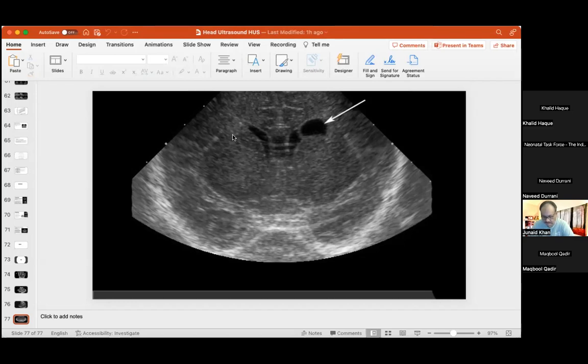I have two comments on your presentation, please don't take it personally. I'm just highlighting it because a lot of junior learners are sitting here. One is about the color Doppler and color pattern on any structure.